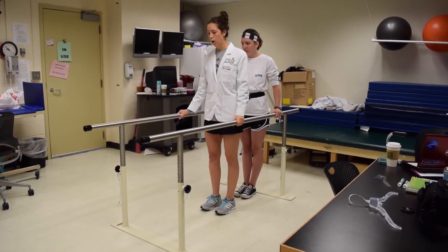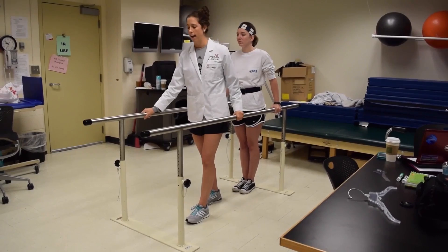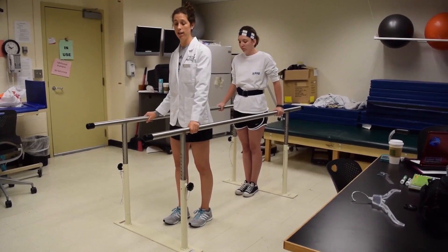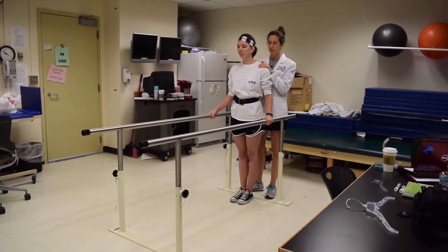When we're ready to start, you're going to take a step forward with your left leg and then move your right hand forward along the bar. Then you'll bring the right foot up to join the left and that left hand to join the right. Before we get started, I'm going to make sure I come back behind Courtney so she feels safe and secure again, same positioning as before.